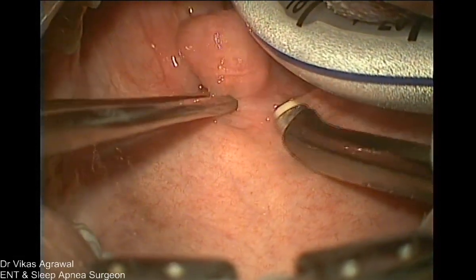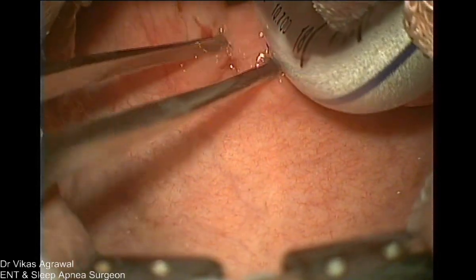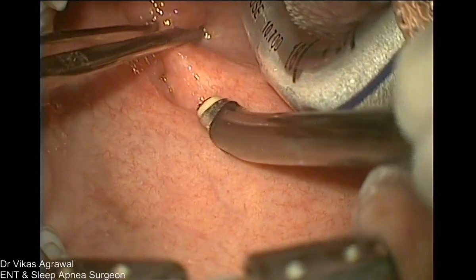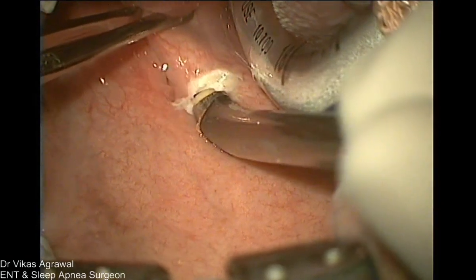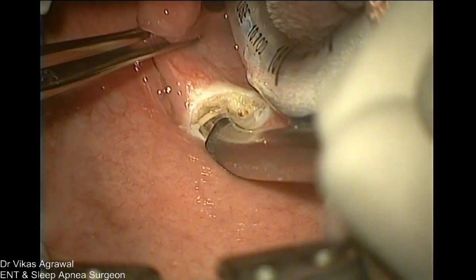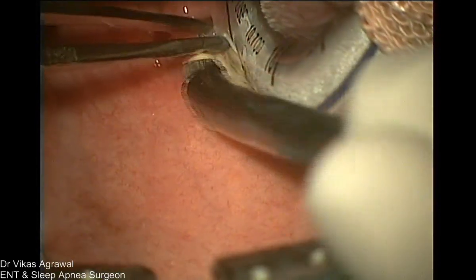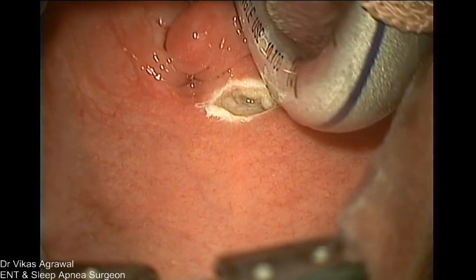So I am removing this uvula. The tube is coming a little in the way, so possibly we can just push the throat back here. I am removing the uvula in line with anterior pillar to anterior pillar. As you can see here, I am using coblation. The advantage of using coblation is that it gives very good hemostasis and will not give any fibrosis. So this is the anterior pillar to anterior pillar. I think we'll have to do something to the tube.